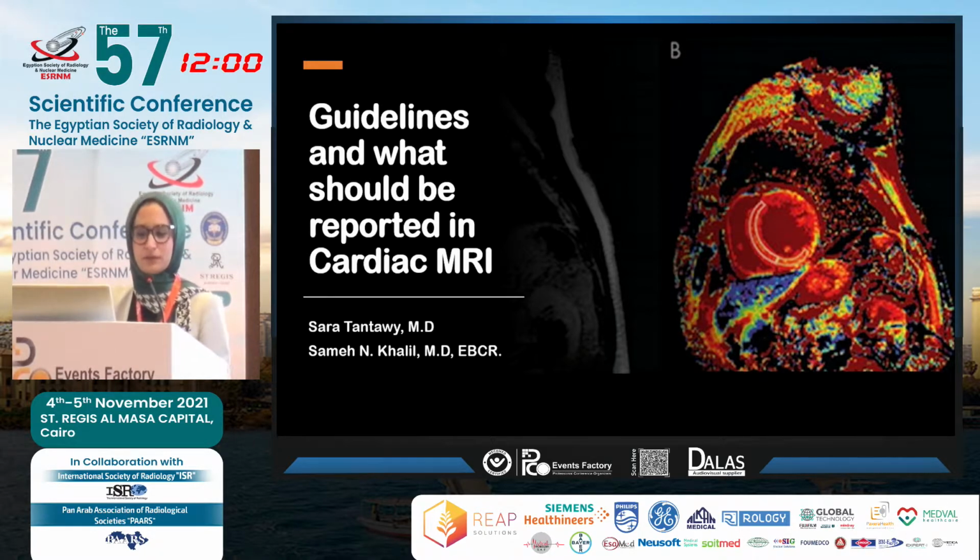I'll be talking about guidelines and what should be reported in a case of cardiac MRI. Actually, my lecture will be somewhat overlapping with Dr. Dunya's lecture, so let's consider it as a form of quick revision and to stress on the main points of the report elements.